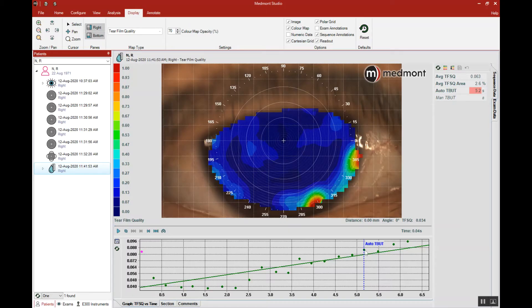Now that we're in a position to analyze the test, the colorized display is not showing us the cornea in terms of shape. It's displaying dark blue where the tear film is very smooth and even, and red where the tear film is breaking up. So we're not assessing eye shape, power, or elevation — we're appreciating the reflection off the tear film overlaying the cornea.